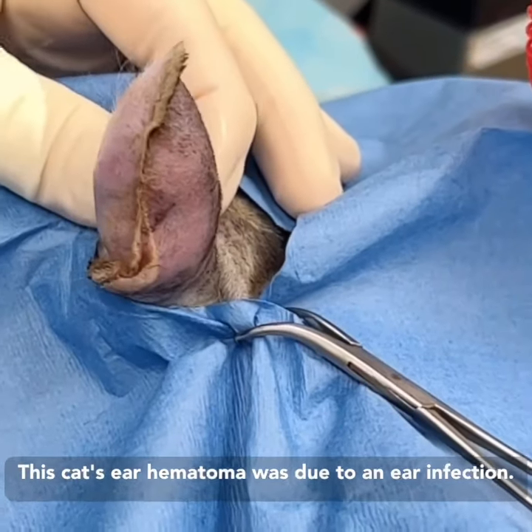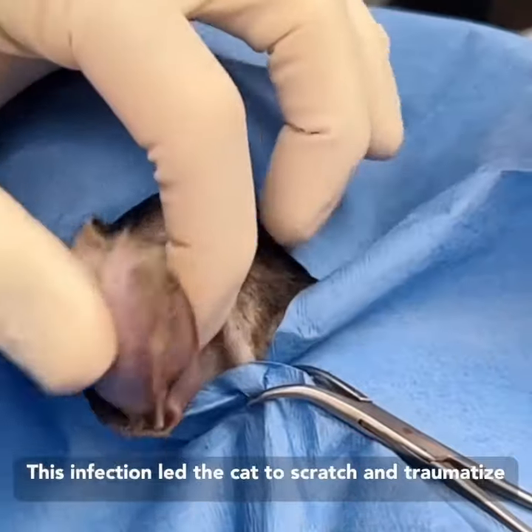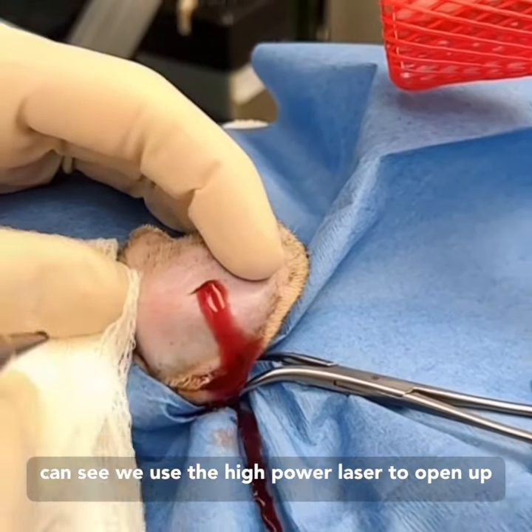This cat's ear hematoma was due to an ear infection. This infection led the cat to scratch and traumatize the ear, and a blood vessel burst. Here you can see we use the high-power laser to open up this ear hematoma.